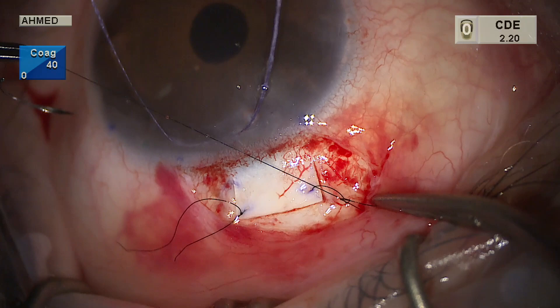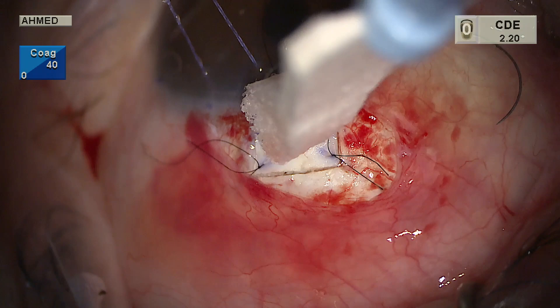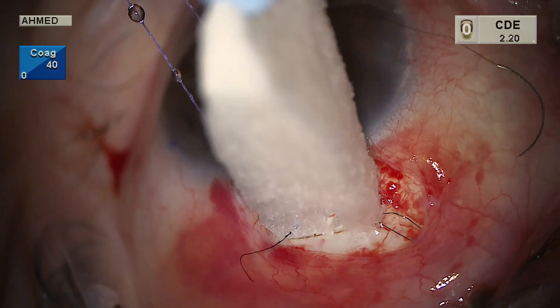Note that the radial incisions are not placed all the way into clear cornea, which prevents the need for additional sutures along the radial edge. BSS is injected into the anterior chamber and the IOP is elevated to over 20. We observe some brisk flow and allow the pressure to drop to the mid-teens. The suture is tightened slightly because the flow is a bit too brisk — we want essentially gentle oozing of aqueous around the flap as pressure is brought down to the low teens.